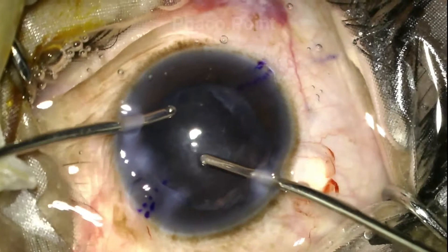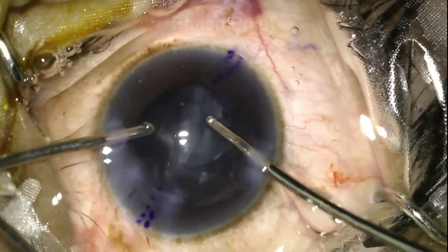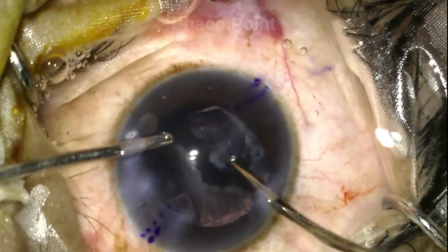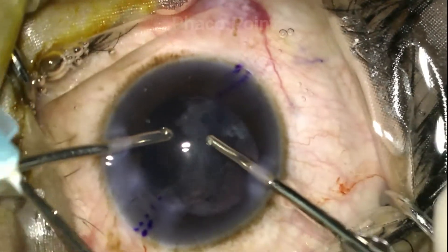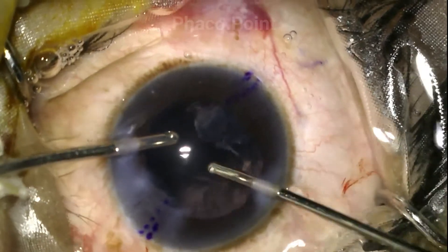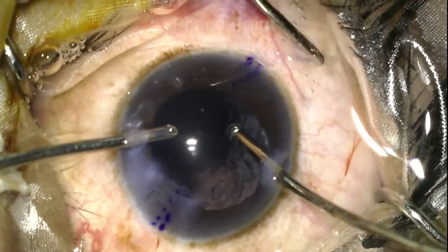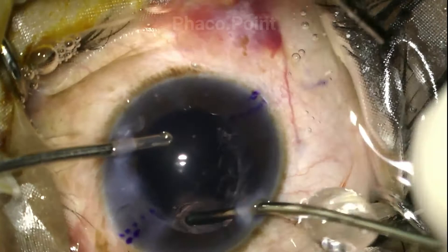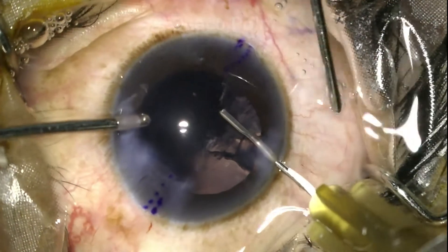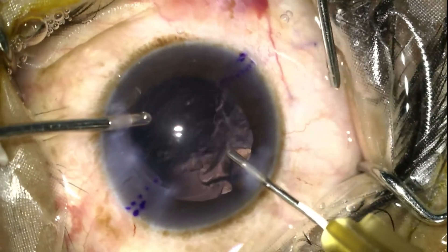However, it maintained a stable chamber. During irrigation aspiration, you do expect excessive aggressive fluid. We are going to be able to successfully complete the irrigation aspiration provided we're able to maintain a stable chamber and that does not compromise the surgeon in accidentally creating a PCR during IA. As you can see, the chamber does remain stable during irrigation aspiration.